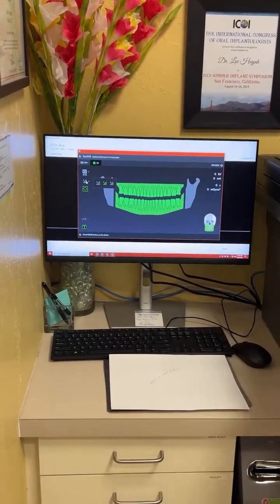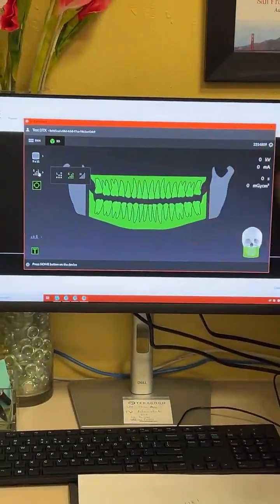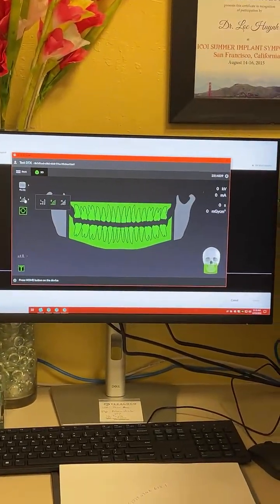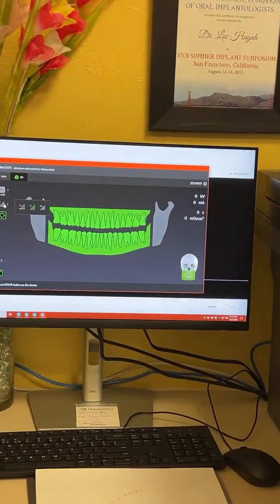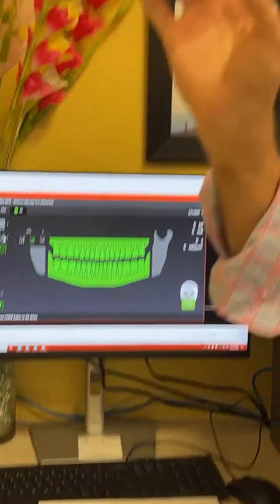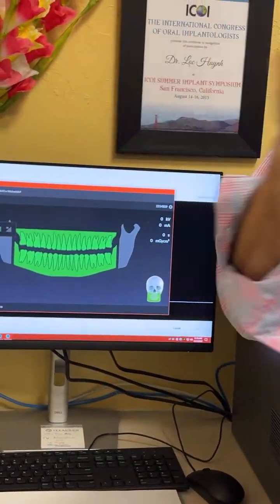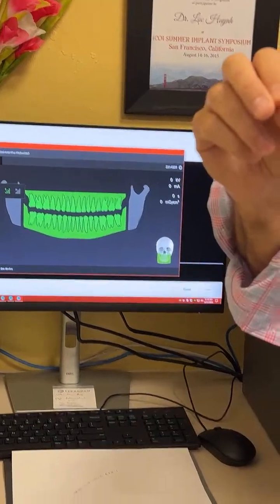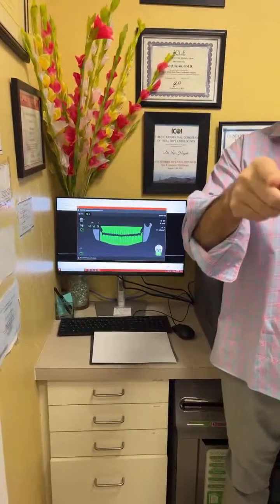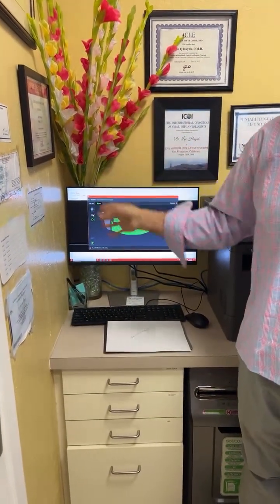Okay, so I have some offices that'll make a laminated sheet, and it's called a CBCT protocol sheet. So you have the patient's name on it, ID, date of birth, male, female, all the pertinent information, and then you'll get into the particulars. What tooth numbers? What resolution do we need? Are we making a surgical guide, yes or no? Right, you're checking on this with a dry eraser pen. Doctor usually fills it out, hands it to the staff, you guys go in, and you set it all up.